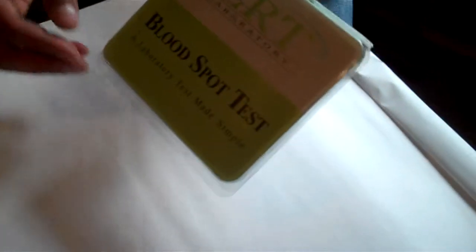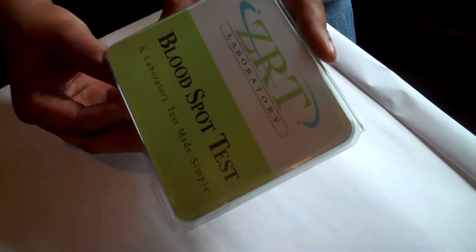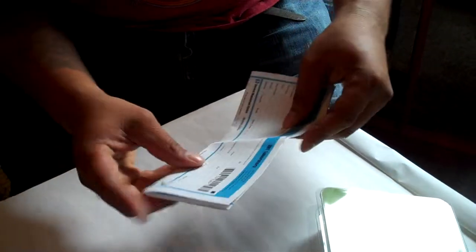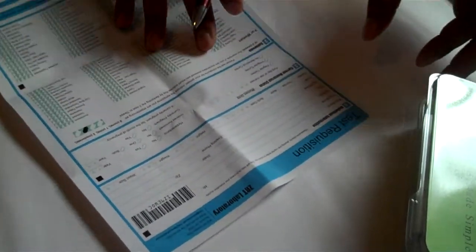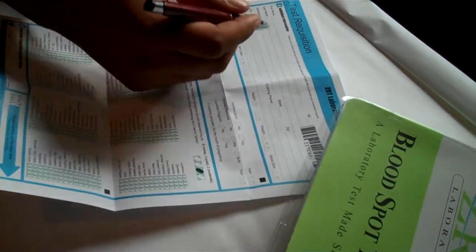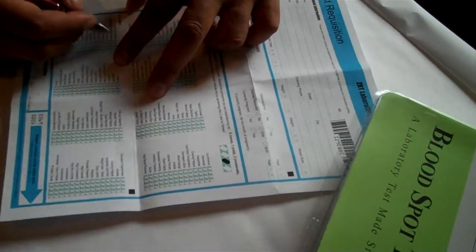Today we're going to go through your ZRT laboratory blood spot test for testosterone testing. We're going to go through this kit to make it as explanatory as possible. You're going to get this kit in the mail via priority mail. This is your information sheet — go ahead and fill this out first thing in the morning, making sure you have not drank any water or eaten anything. That's when your testosterone will be checked in the most clean manner. Fill out the individual information sheet — it will go on record at ZRT laboratories. Skip the middle section, it's for women only, then come down to the men's section and complete it.